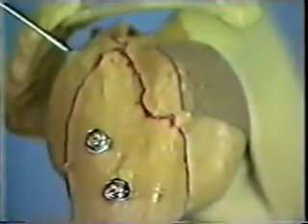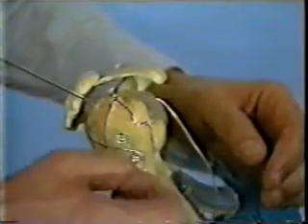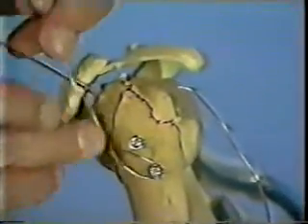The most important part of this internal fixation is now the placement of the tension band wire. In the human, we can place the wire through the insertion of the rotator cuff, where the Sharpey's fibers provide a good anchorage. This can be done with the help of a pre-bent cannula. In our bone model, where the rotator cuff is simply glued to the bone, we cannot use the same technique. We therefore drill a 2-millimeter hole between the lesser and greater tuberosities, rather tangentially, so as to grab both of these structures, including the cuff. A 1.2-millimeter wire is now pulled through the hole and anchored distally with a figure-of-eight around one of the screw heads, including the washer.